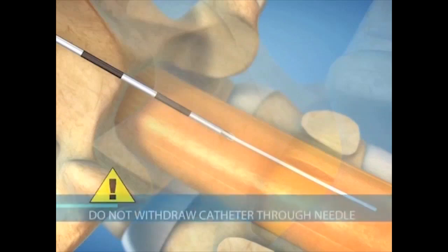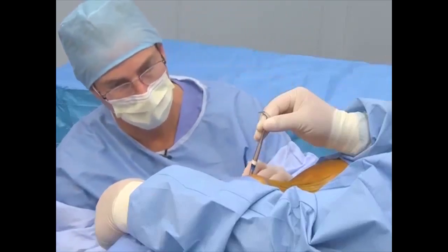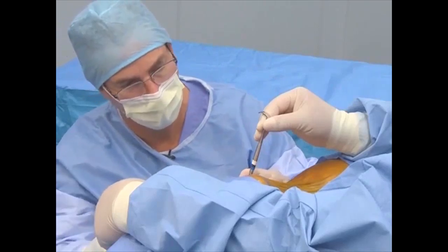Do not withdraw the catheter through the introducer needle. This can partially cut the catheter or completely shear off the catheter end. A partial cut can cause drug leakage, while a complete shear can leave a disconnected catheter segment in the intrathecal space. For more information on preventing catheter-related complications, consult your Medtronic representative.